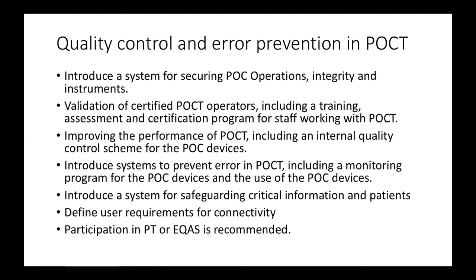For this, introduce a system of securing point of care testing operations, their integrity and instruments. You have a system of who will operate and how the person will operate. They are trained. Nobody is tampering with this point of care testing equipment.